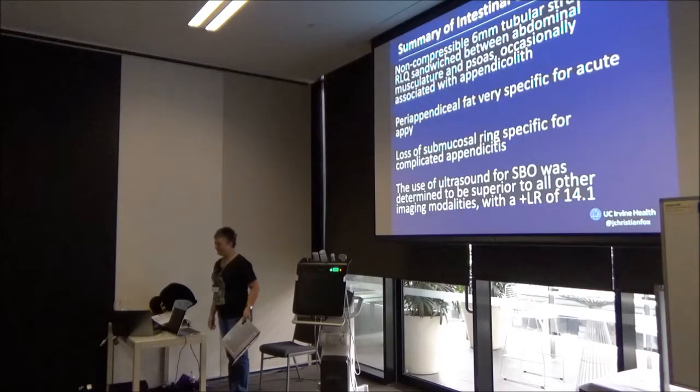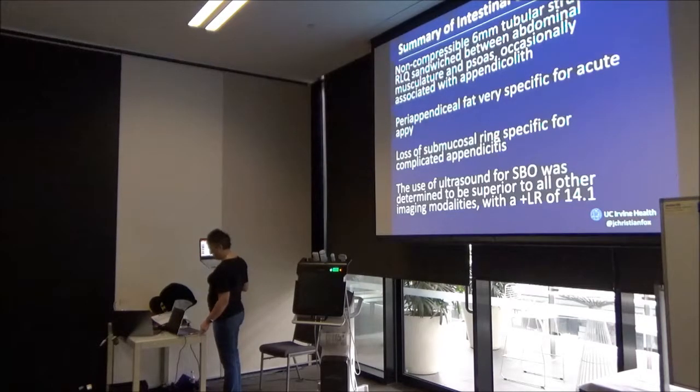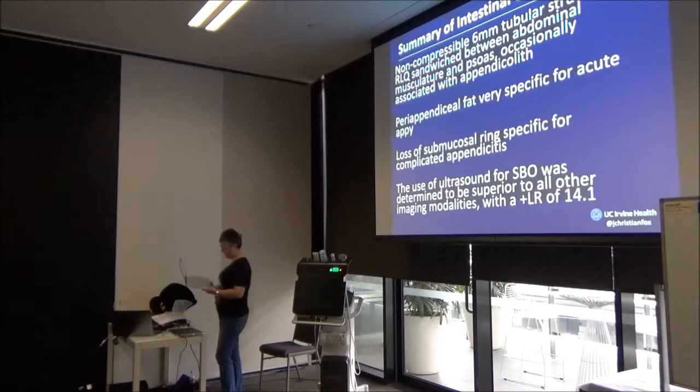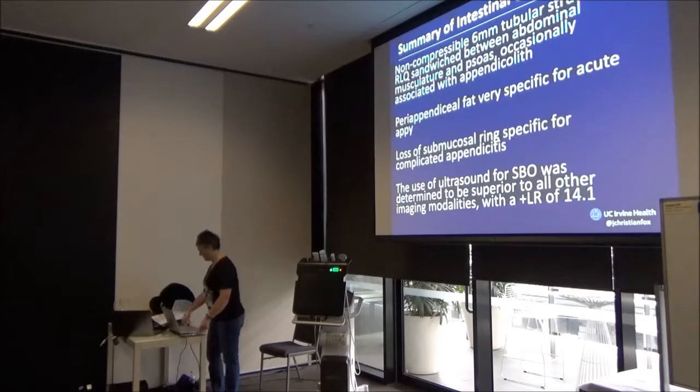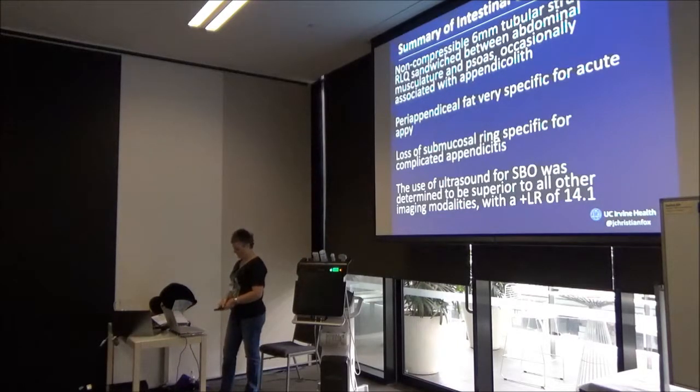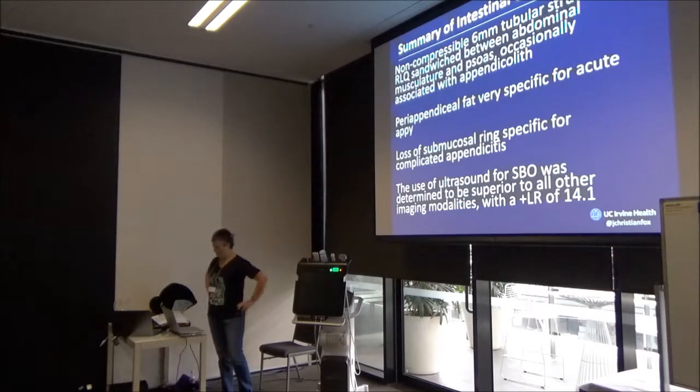And so what you do is, I start in a transverse plane, and I do this kind of zigzaggy thing over the belly. I just go side, down, over, and then I go sagittal, and then I go up, over, up, over. I just keep going in this kind of mowing the lawn, right lower quadrant, covering a lot of territory, compressing every centimeter as I go. So I start transverse, and I just compress, move, compress, down, compress, move, down. And I just keep doing that, sagittal, transverse. Graded compression technique in the right lower quadrant. Does that make sense?